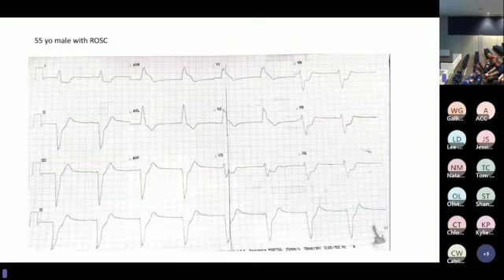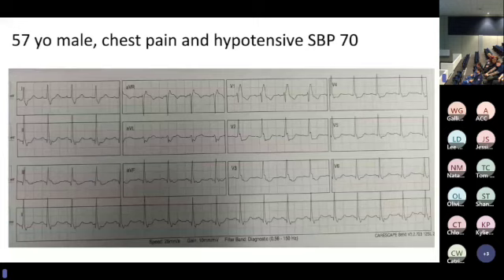So if you go back to the previous one, they're not particularly tachycardic, and I suppose, as with most findings in medicine, you say the sensitivity is only 44% for sinus tachy, and that probably really depends on what their inclusion criteria are. If they're looking at shocked, horrible patients with PE versus just anyone who had an intermediate or higher VQ when they did the study. Yeah, that's a good point.